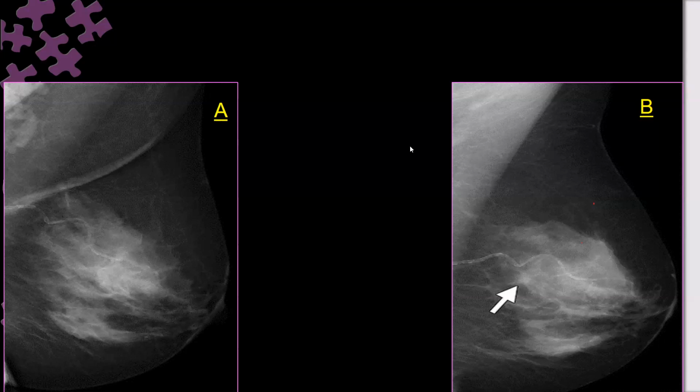So why have you seen this? Why not the reverse? Why is this not a pseudo lesion? Okay, they start with B and then they change, and that pseudo lesion disappears in A. Maybe. Okay, so you are not sure. Who is confident of his answer?